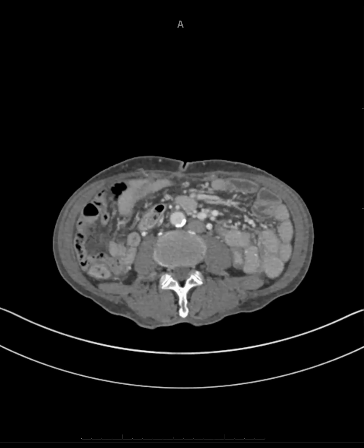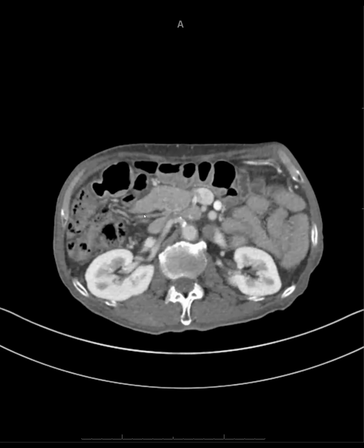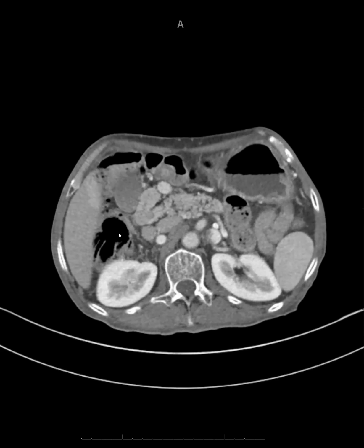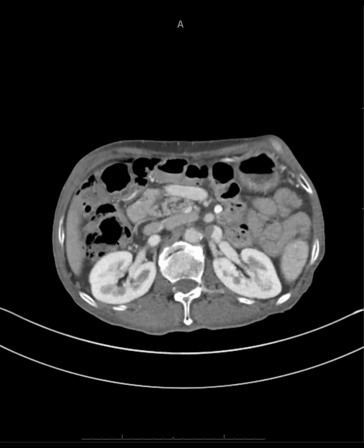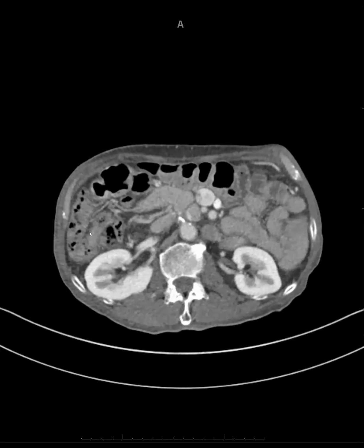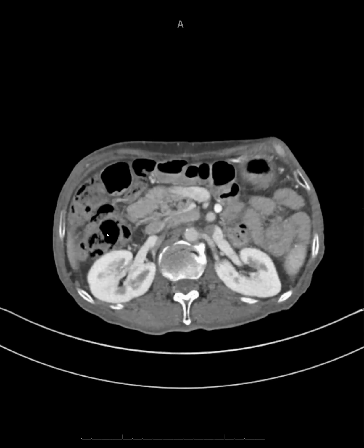Tell them what we thought about the free air and the findings associated with that. Absolutely. Within the context of a failure to thrive history. Yeah, so we have a mobile cecum. We found our cecum up here in the right upper quadrant, and then we saw some bubbly lucencies in the wall of the right colon.